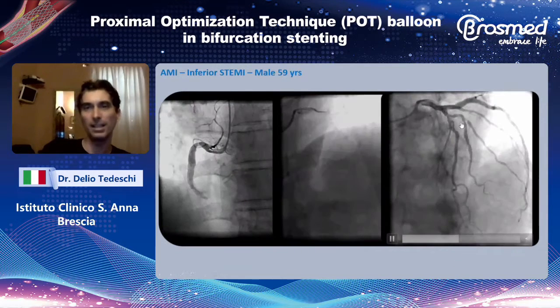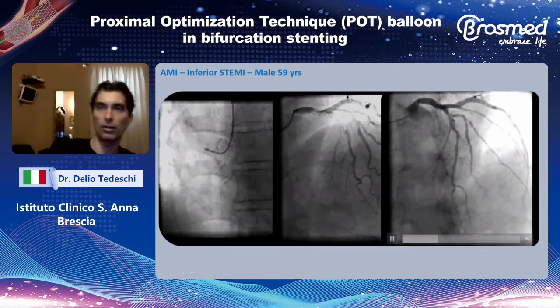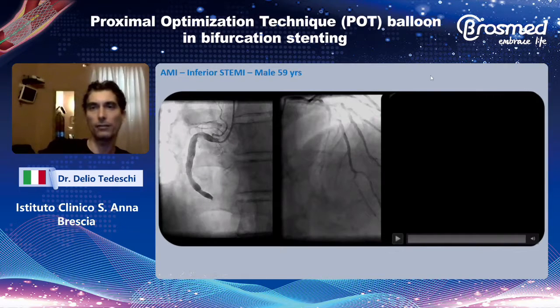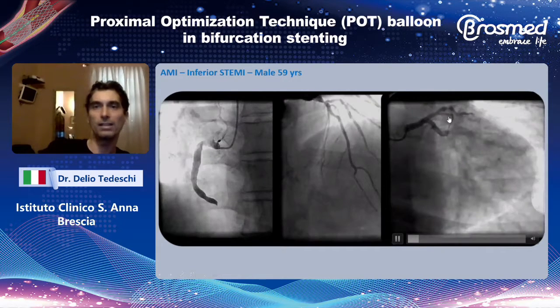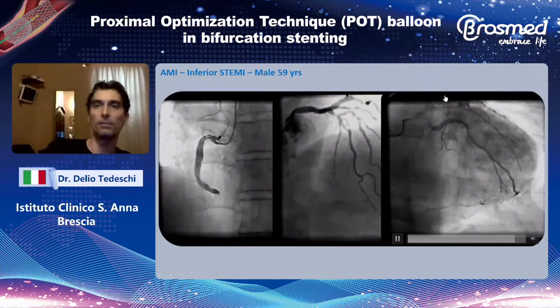But above all, we see from the diagnostic angiography an aneurysmatic portion and some ectasia even at the level of the proximal LAD.